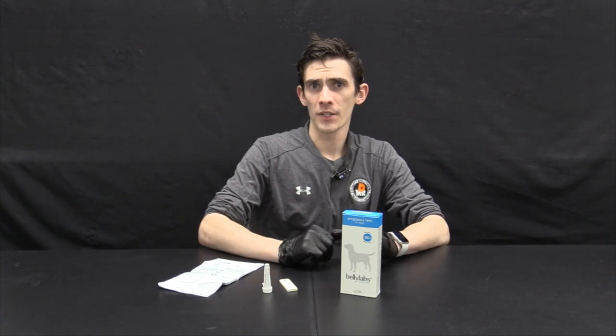Do you hate needles? So do I, so does your dog. Actually, be careful to dispose of any sharps and used needle syringes in accordance with local and state ordinance. They are potentially hazardous and sharp.